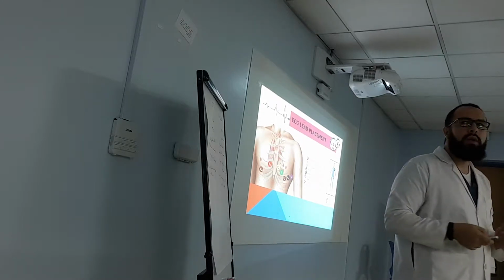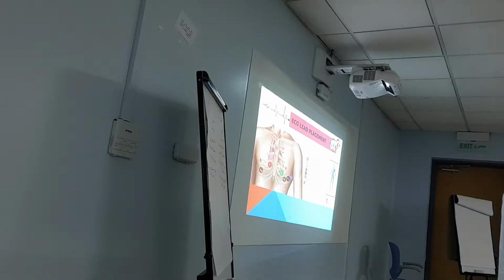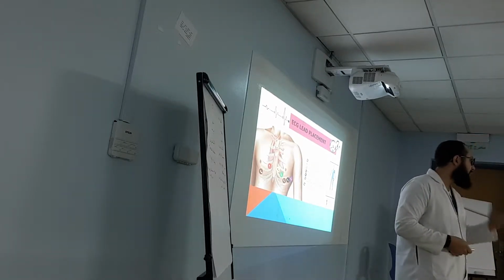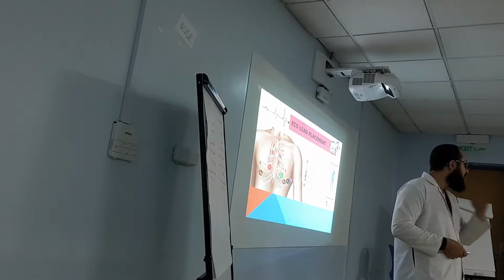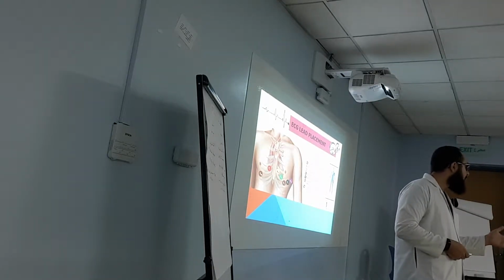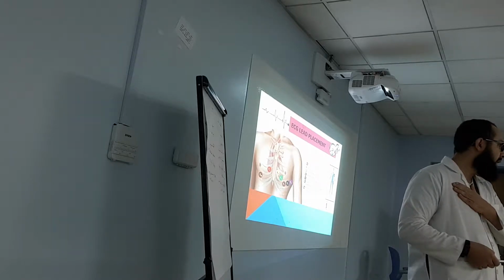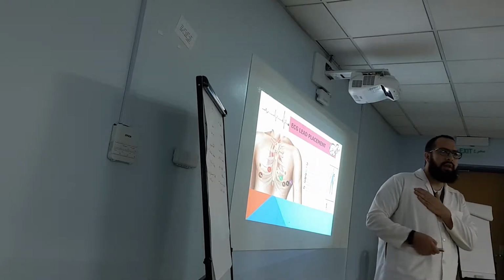When you do placement of the lead, you need to prep the skin. So how to prep the skin? Who can tell me? If there is hair, remove it. What else? Yeah, dry. What else? Also, if it's dirty, clean. Cleaning, yeah. And also avoid interference from other electrical devices.